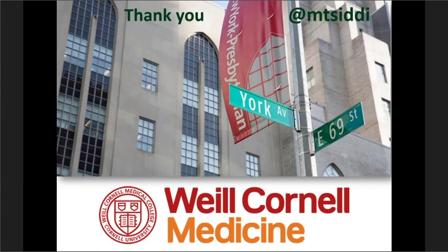There's a couple of questions about neuroendocrine tumors. Seems like this was a tougher area. Question is, do you grade the neuroendocrine tumors on FNA? Do you feel comfortable? Do you use the cell block for Ki67 for grading the neuroendocrine tumors? And also how to differentiate grade 3 PanNet from pancreatic neuroendocrine carcinoma?